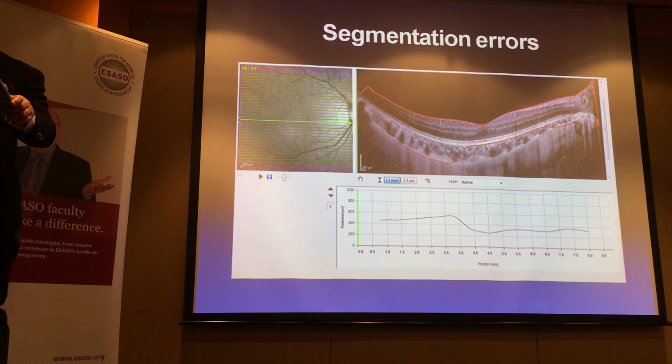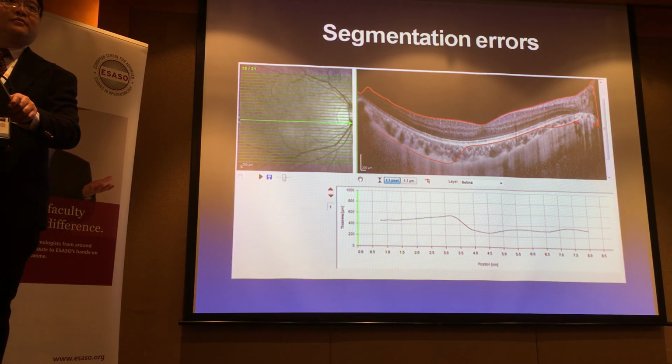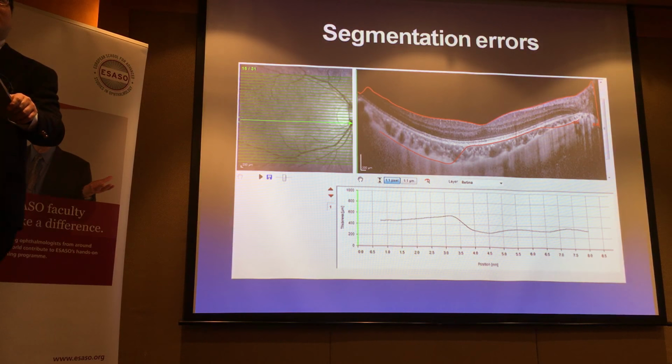Right. What I think you're trying to point out is to have the patient wear the regular refractive trial frame, put a +10 diopter lens in front of that, and then capture the image. The issue is that because of the refractive change, you're not able to see the infrared or the autofluorescence image. So you're basically just blindly trying to focus, and as soon as you get any semblance of a scan, just capture that. The quality is not that great, but yes, you can magnify it quite a bit. If you have, let's say, a 12 mm scan on the regular machine, it can go up to about 16 to 18 millimeters. But it's a blind procedure, because the IR or the autofluorescence image is not there.